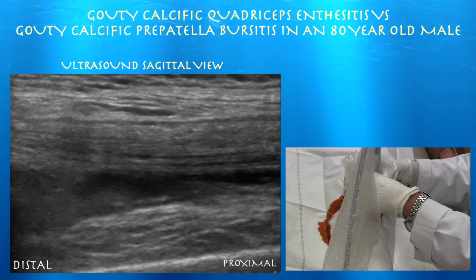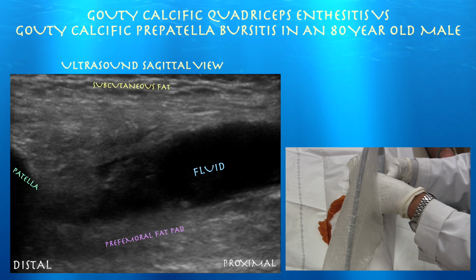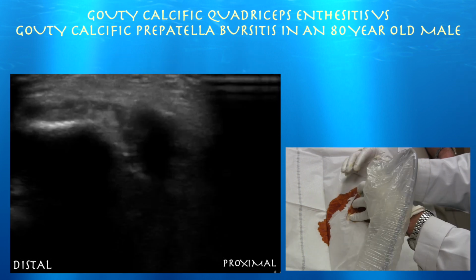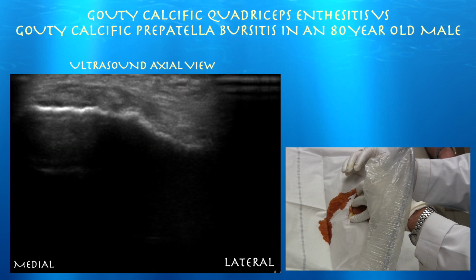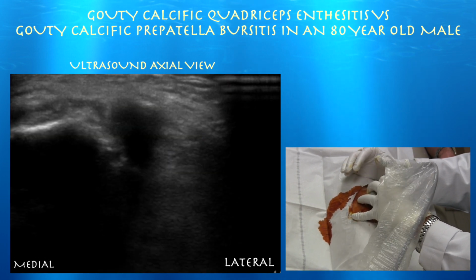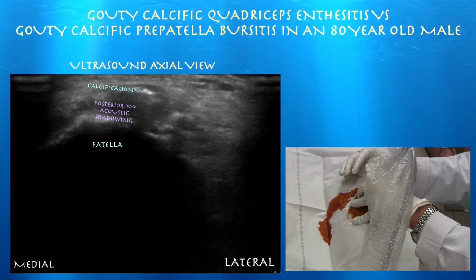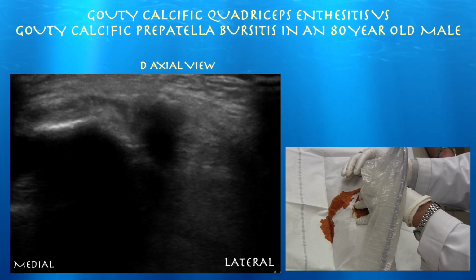He does have some fluid in the knee joint, actually a fair amount of fluid. Here's the lateral suprapatellar pouch. You can see a fair amount of fluid in the joint itself. We are short axis now to the quad tendon, or axial view. Right side of the screen is lateral. We've got his patella, and then you can see some of that calcification laterally. We have some posterior acoustic shadowing, which you may confuse for fluid. It's just shadowing from the calcium. Again, I think it's really an enthesitis, a gouty enthesitis.